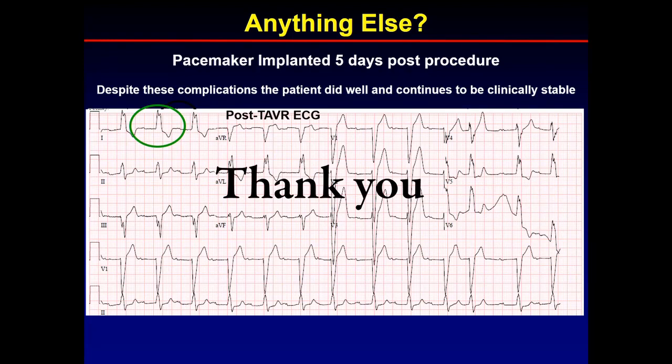Some centers use it in 70% of the cases. In our center, we use it in maybe 3% of the cases. When do we use it? Like yesterday, we used it because the patient already had a stroke and she had a mobile thing on the arch. So we would use it, but is it really helpful? We really need a large randomized trial to support routine use of that.